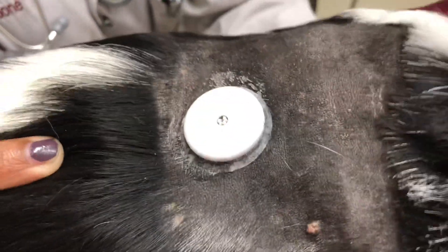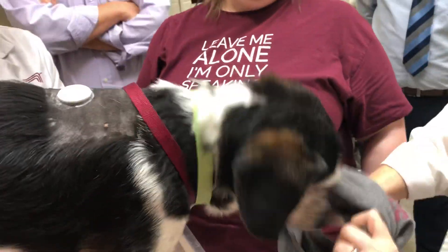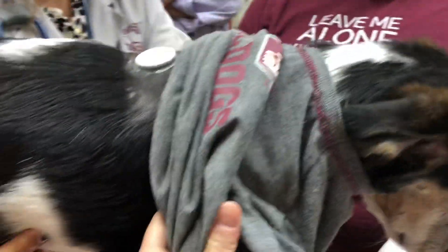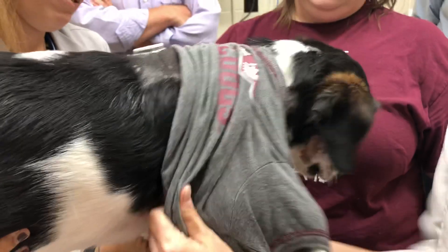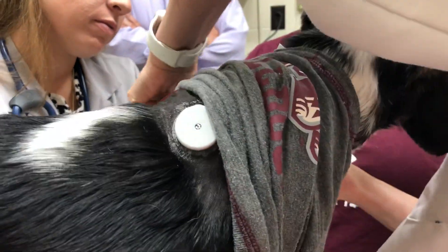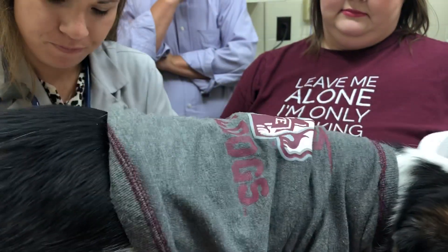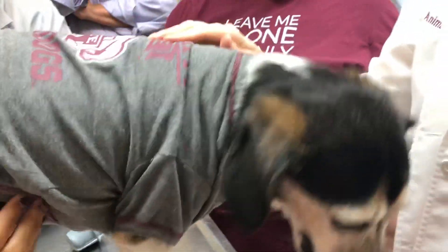Watch how excited Buddy gets about this — Buddy loves wearing t-shirts! He wears a t-shirt and we cover up the sensor. We put his legs through like a child and we'll take his leash off in a second.